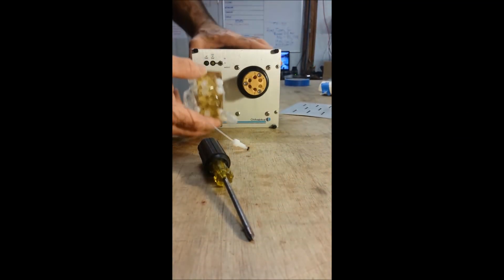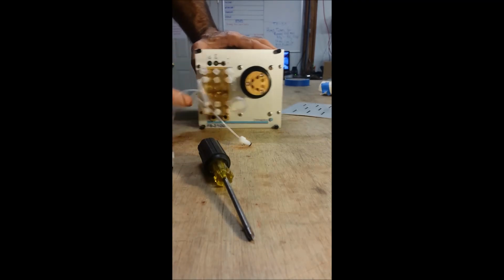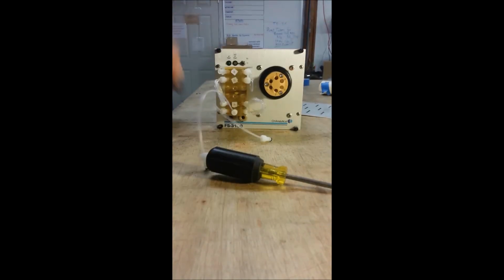You've got your connection here that you can put to the heaters, and then always flow test it. Look down inside to make sure it's not leaking on any of those fittings, and you're good to go.